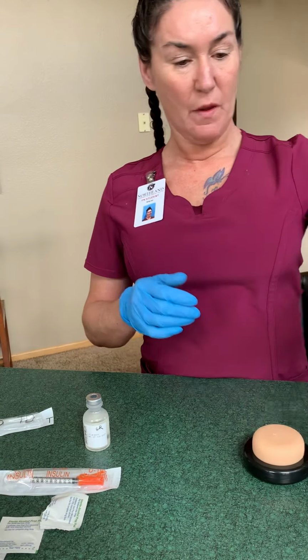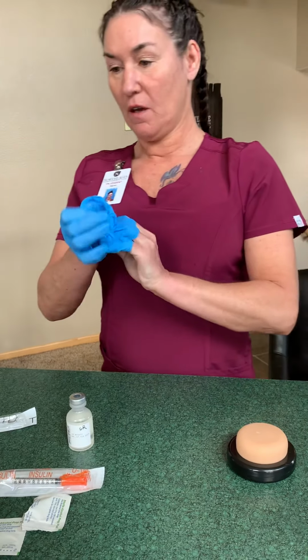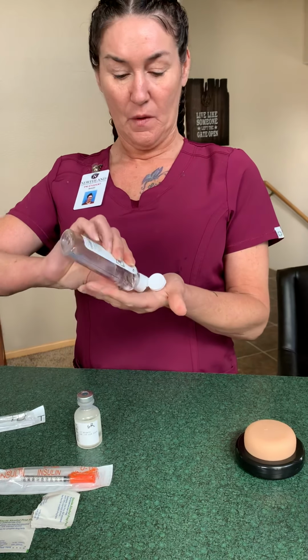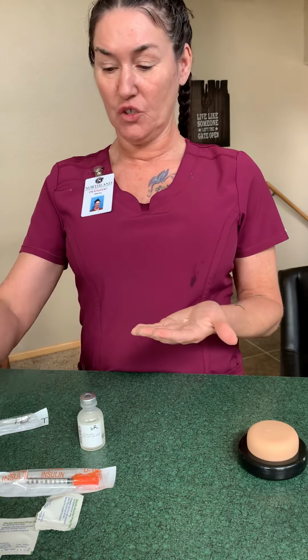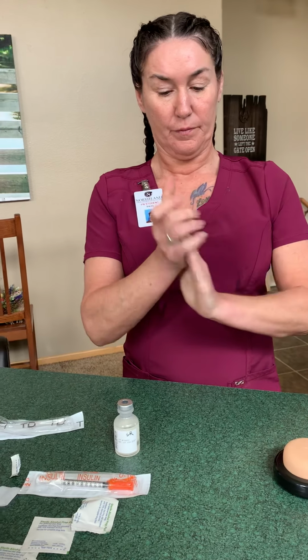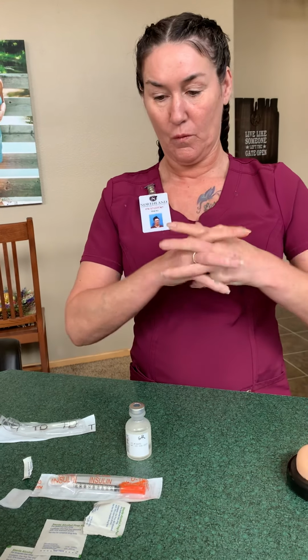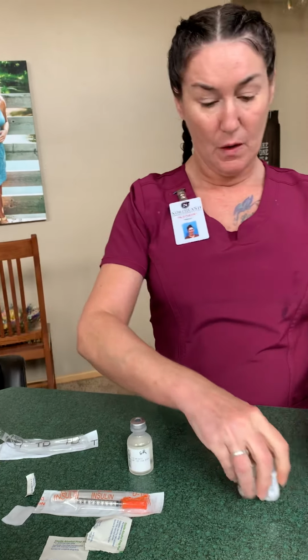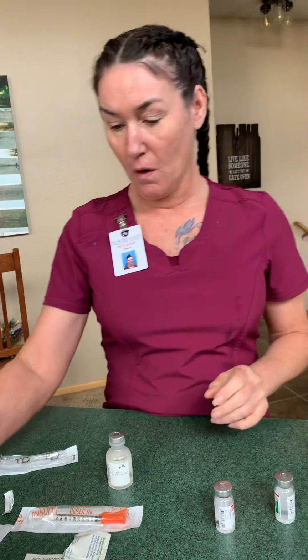Next, we'll move on as I take off my gloves, wash my hands, and then we can move on to our insulin shot. We'll want to start again by cleaning the tops of our vials with our alcohol pads.